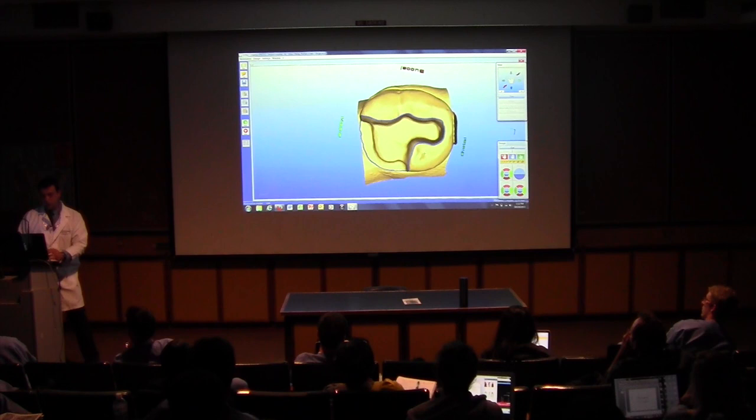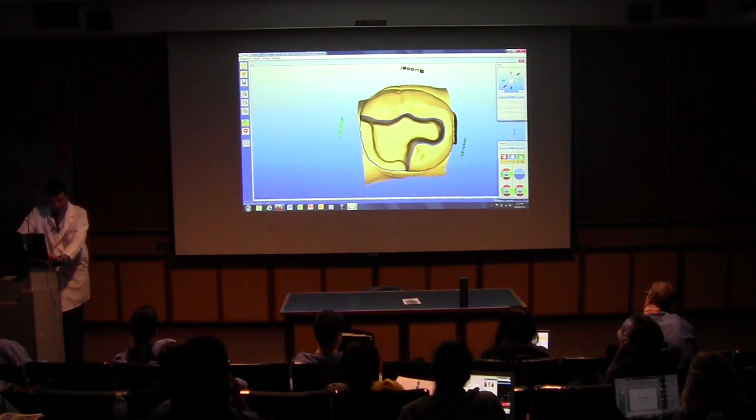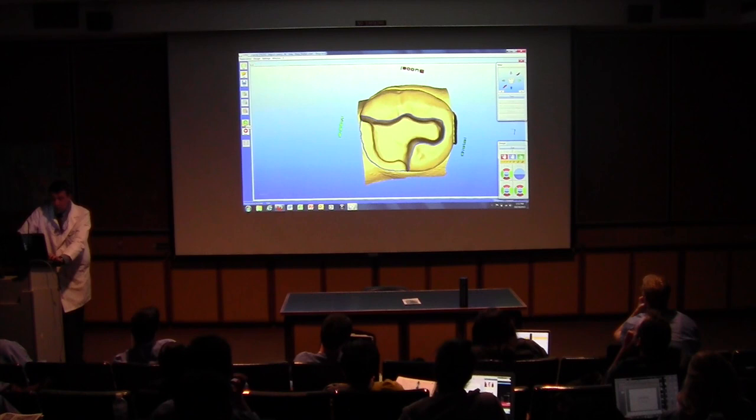So play with the margin finder. If you want to go back, just hit undo, and you can do the whole thing again. Do it over and over again. If you're happy with your margin, you look at the virtual model, and yeah, it looks okay. I think the margin is right there. You're going to hit next.